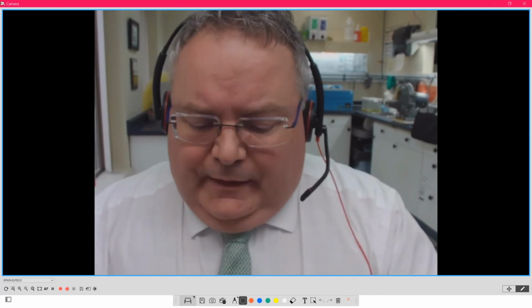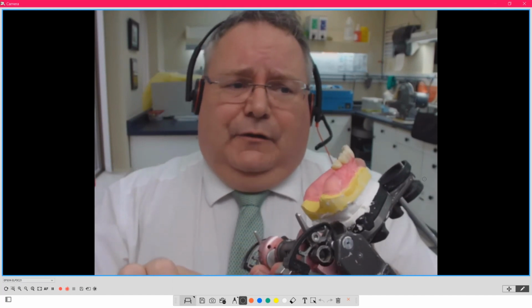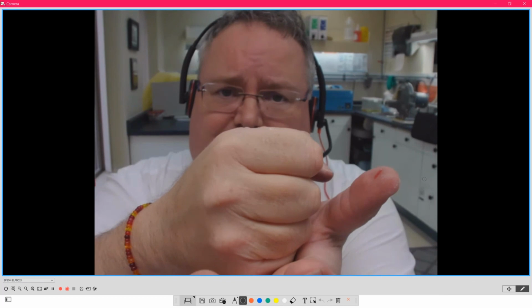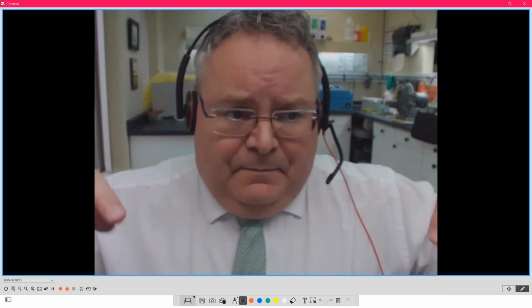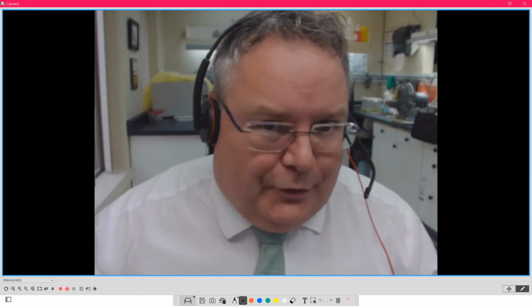It's also that the teeth are finding 3-point centric, so that it's, as VITA calls it, an easy find centric, which means all that does is there's a cusp and it sits in the fossa and it's tripoded and it's done. So you'll find that these teeth zip into centric really quickly, and then I don't care what cusp goes into what fossa. Just remember that if it's not sort of the designate, which means a first molar over a first molar, if I have to put a second premolar or a second bicuspid over top of say a lower molar, just the cusp is smaller.